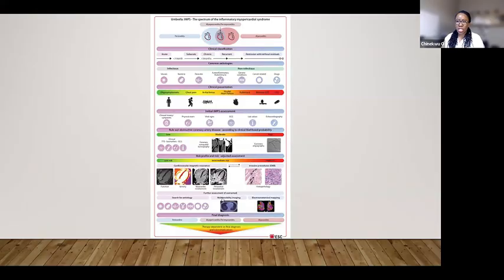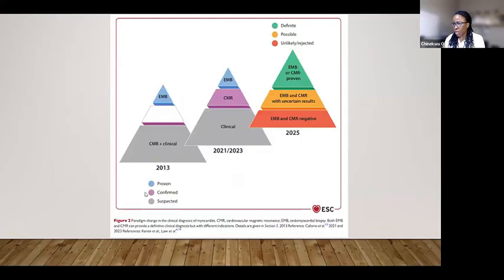And then, depending on what they do have, they may actually need further investigations. They may need PETs, nuclear testing. They may need electroanatomical mapping to guide their ablation if they are very arrhythmic and need that urgently. So, eventual therapies really for these patients depends on what we get out of a cardiac MRI. And there's been a shifting paradigm in the diagnosis.